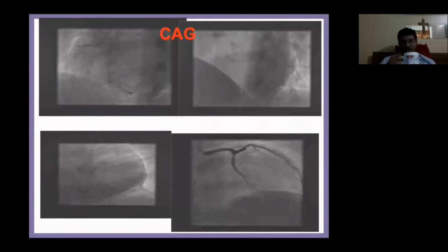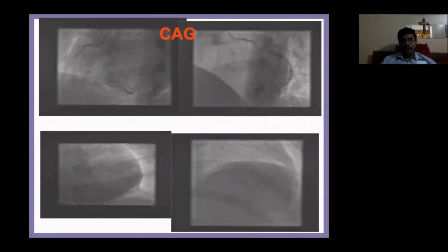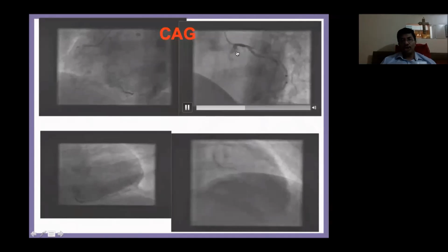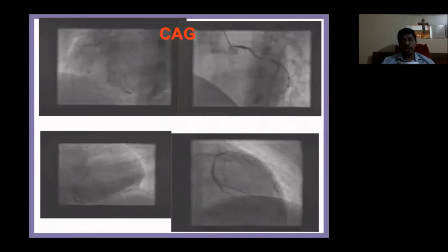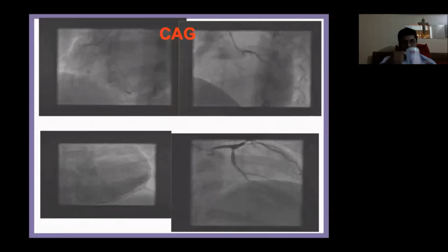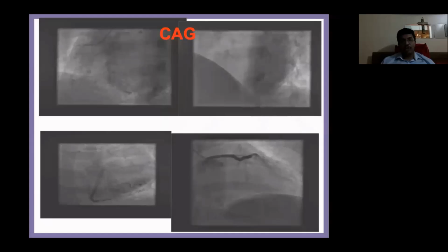Yes, so I can see that clearly. The top right hand corner, if you look at, and I see where my mouse is. That is the origin, ostial occlusion of LAD. Yes. And that's where also the stent has been implanted. Okay, it's a stent.